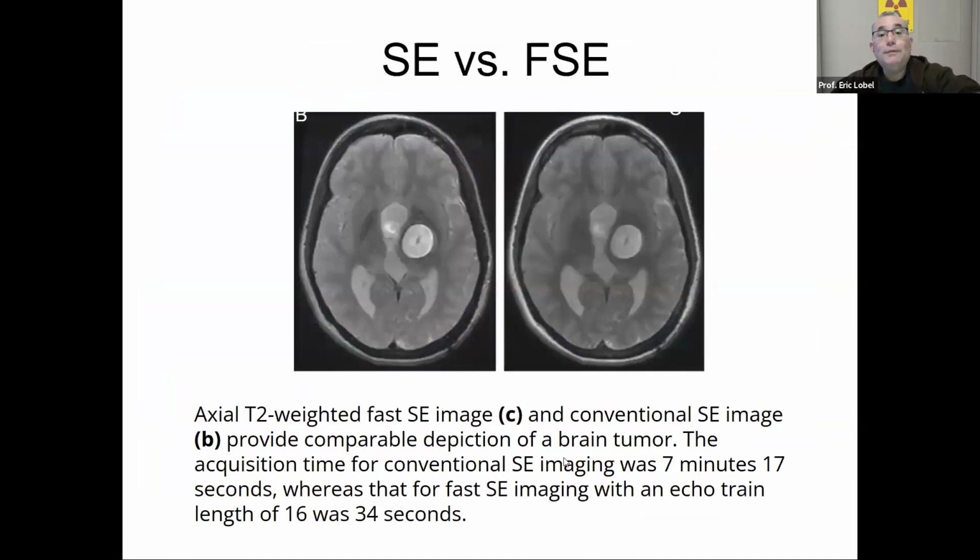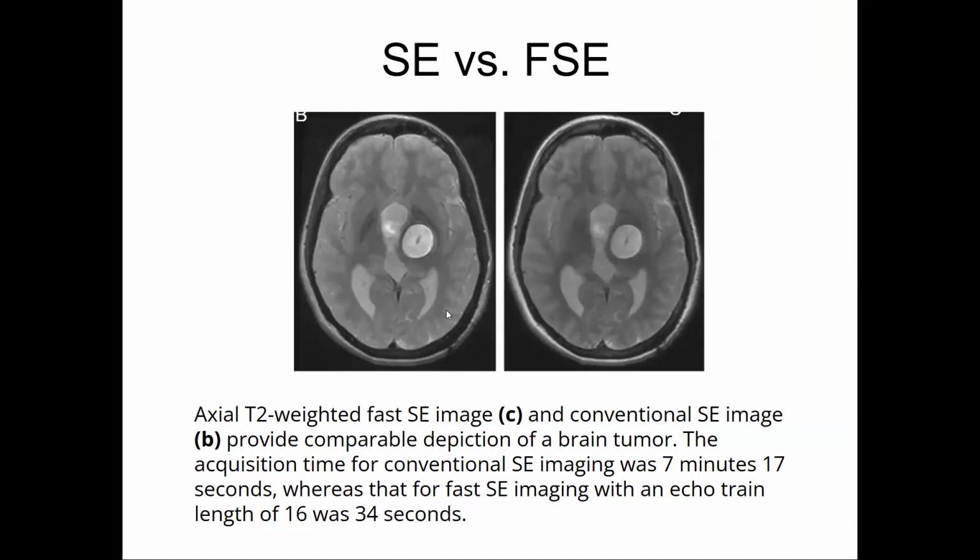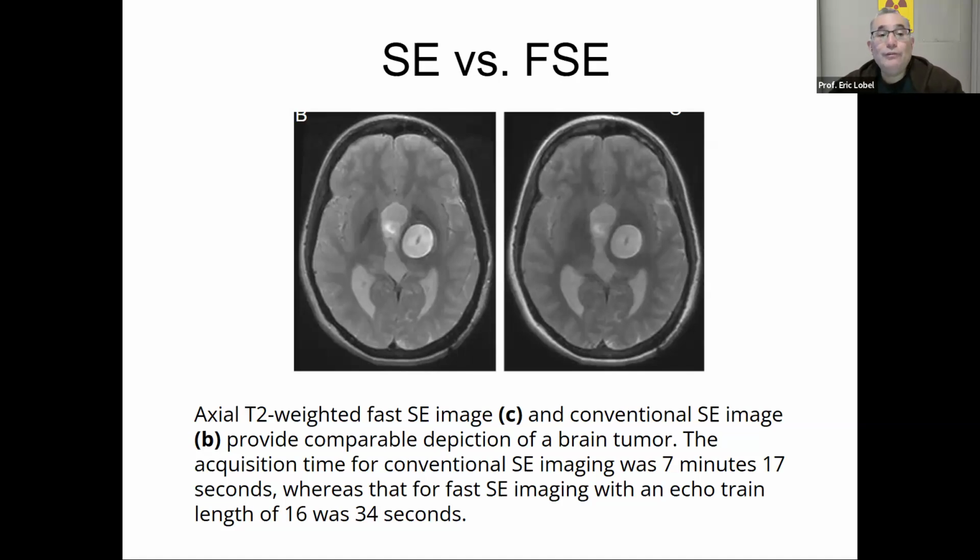So now, don't look at the bottom yet. Just look at the images. Which one looks better, left or right? Grant, what do you think? Left. Yeah, I think, well, you weren't Grant, but okay. Left, I agree. This spot is brighter than this one. You have more signal here. But is the one on the right absolutely terrible? It's not. And I'm going to give you another reason why we can do this also.